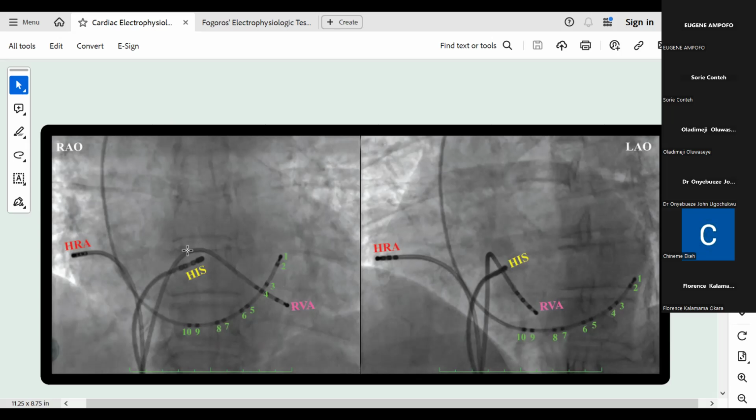I was like, what are you talking about? The EP trainer came and took the second puncture, the third, the fourth. I was like, do you want to kill this patient? They can take up to 4, 5, 6 punctures, because it's a vein, and it's very easy to close the vein back. You won't do that for an artery.